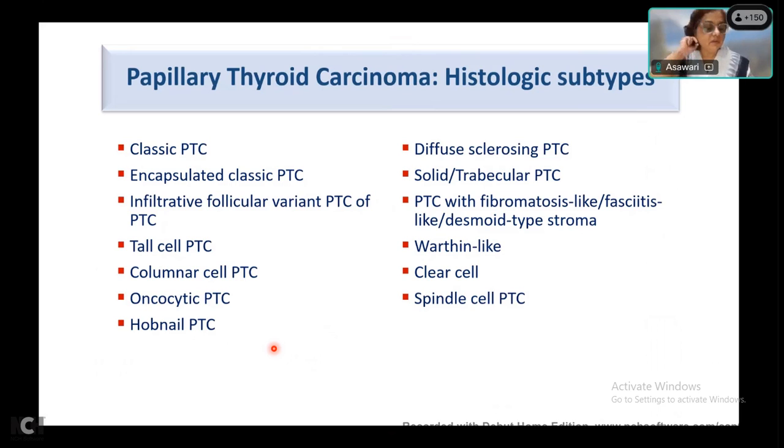You have to find out the size of your field and accordingly do that. So roughly 8 to 10 fields. If you are getting more than 5 mitosis or necrosis, then it is altogether a different entity with a poorer prognosis. So make sure that you don't miss these aggressive features in any papillary thyroid carcinoma cases. They are not very common, but they are not so uncommon also.